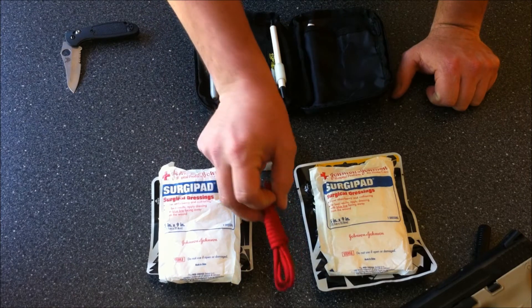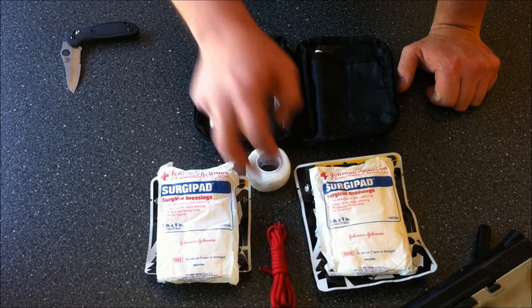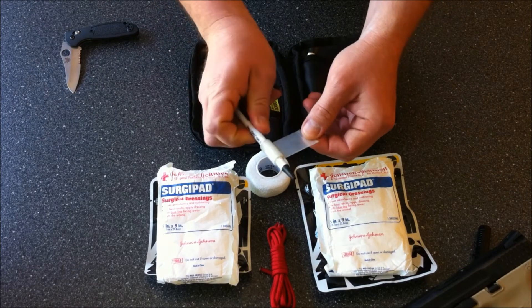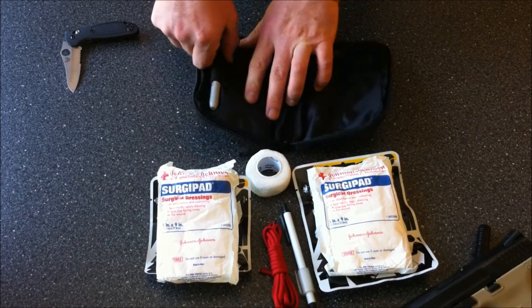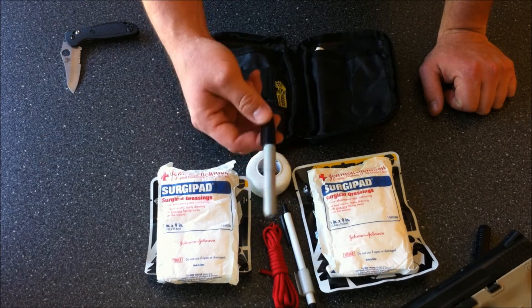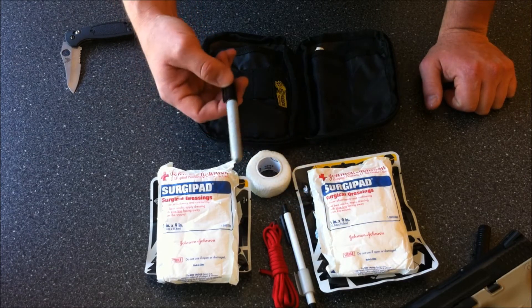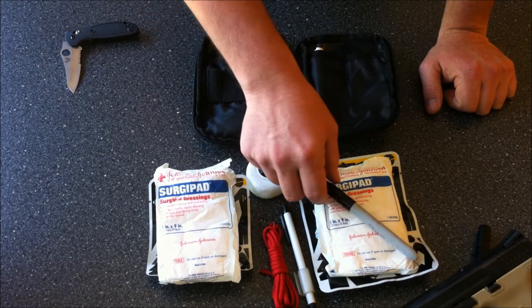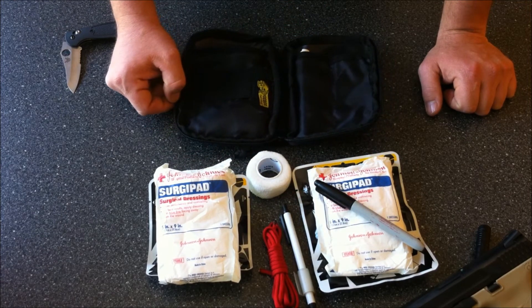The next thing that may be needed is some kind of tourniquet material. I have about 6 feet of paracord in here, a pen with about 10 yards of medical tape wrapped around it, and a Sharpie. If you have to apply a tourniquet or the QuickClot, you're going to write on the skin what time you applied it — for example, 0535 for QuickClot and 0545 for the tourniquet — so when fire and medics arrive, they know when those treatments were applied.